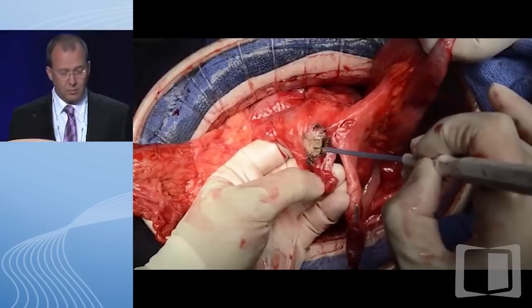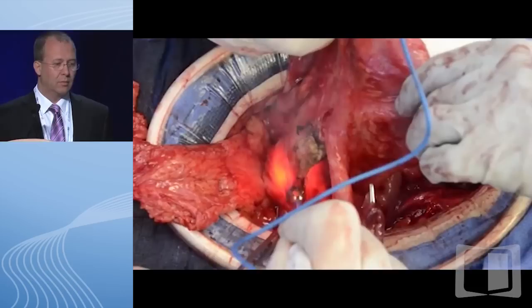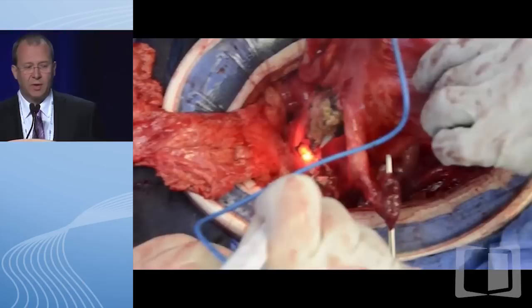As a new pouch needed to be created, a loop of small bowel was identified which would extend towards the pelvis. In order to increase the length of mesentery, a number of procedures are performed. Any excess mesentery is excised with transillumination of the mesentery to ensure that the vasculature to the pouch is not damaged in any way. He's very close to the SMA there.